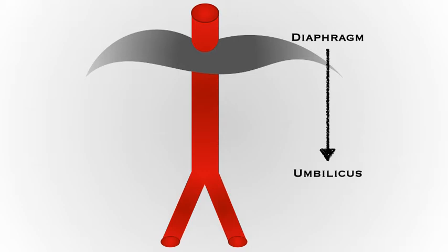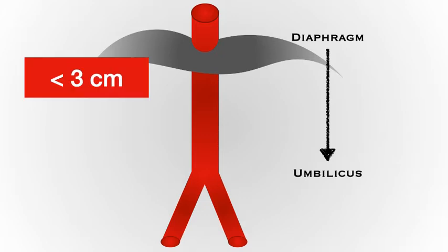The abdominal aorta normally tapers as it courses distally and has a maximal external diameter of less than 3 centimeters. The aorta is usually less than 2 centimeters when infrarenal and less than 1.5 centimeters at the bifurcation. It is important to recognize that a normal aorta tapers in size, since a non-tapering aorta may actually represent an aneurysm as well. But in general and POCUS, an abnormal aorta evaluation would be anything measuring greater than 3 centimeters.